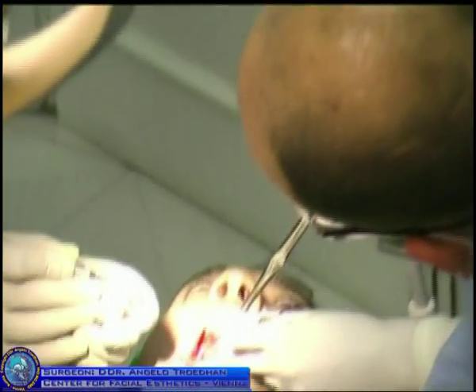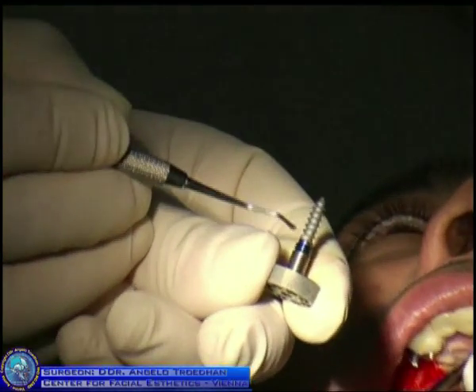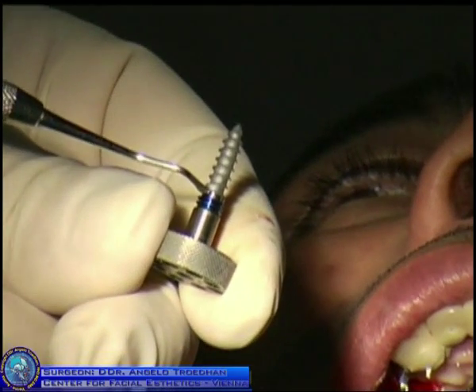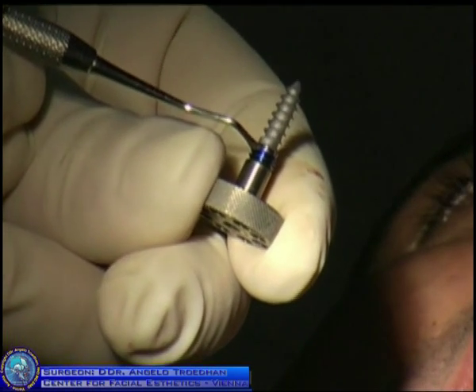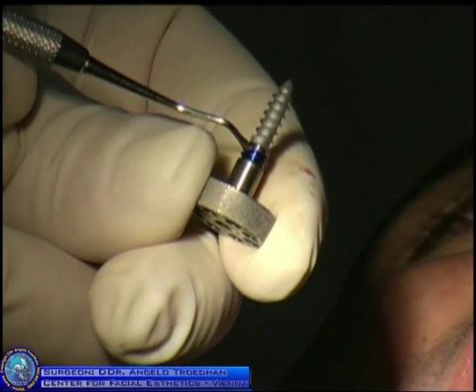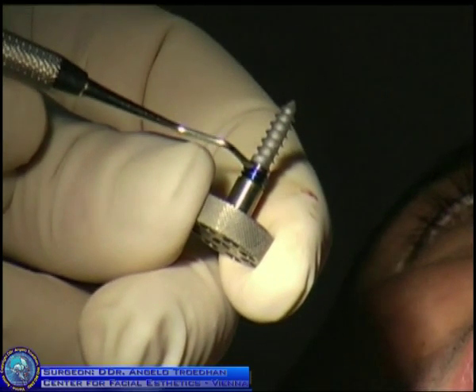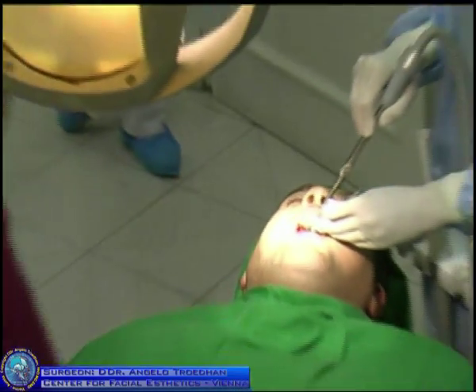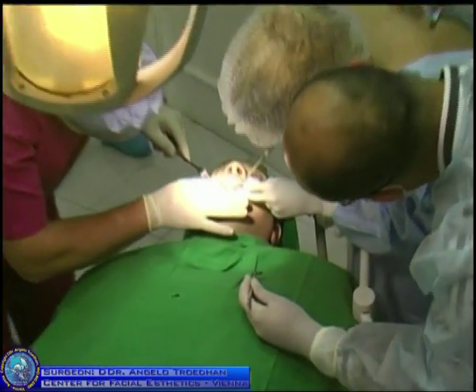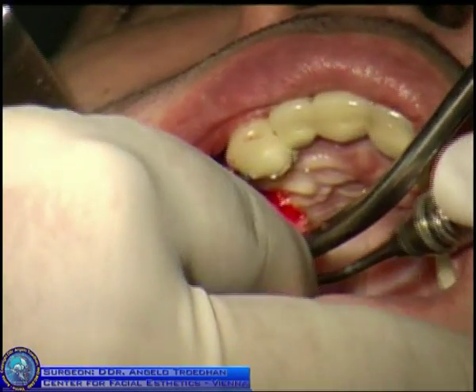So the Q implant system, and the explanation is very simple. For the Q system, the length is counted where the threads end. And there is a polished part, which is another 2 millimeters. And since I'm influenced by German implantologists, I want the implant to be flat inside the bone. So actually this is a 14 mm implant.